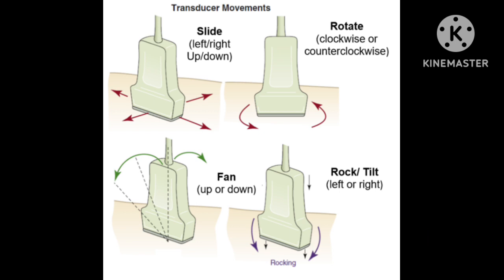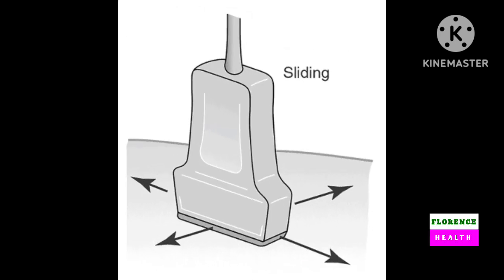You can slide the probe up and down and from right to left. Again, sliding can be done in narrow axis, also along broad axis.